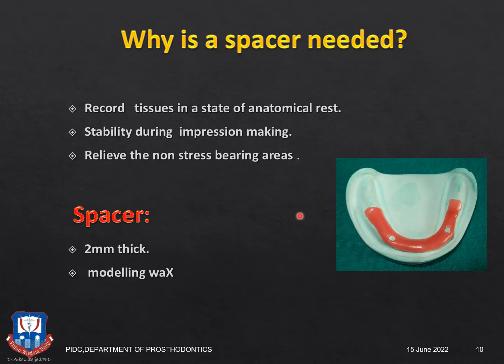So why do we need a wax spacer? As most of you must be aware, the tissues should be recorded in a state of anatomical rest.